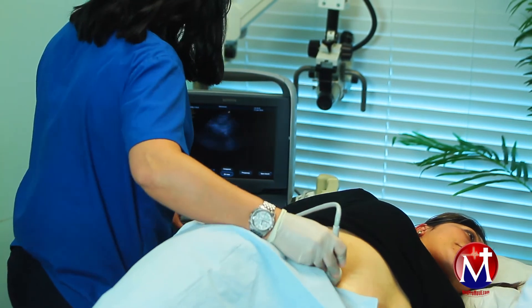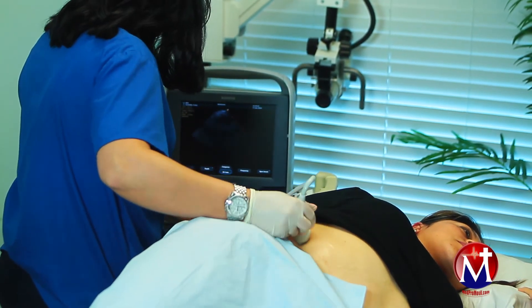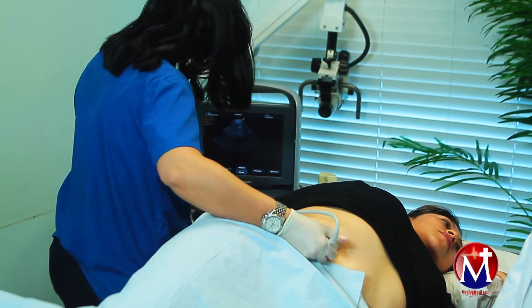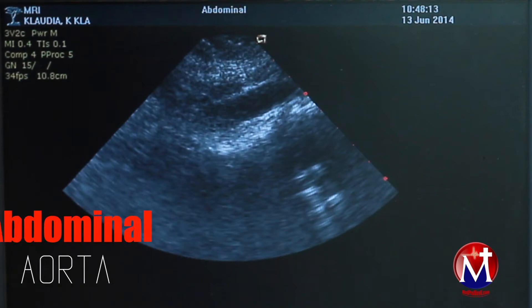Layla is doing an abdominal sonogram on this patient who presented to her physician with right upper quadrant pain. Right now she is scanning the patient's abdominal aorta.